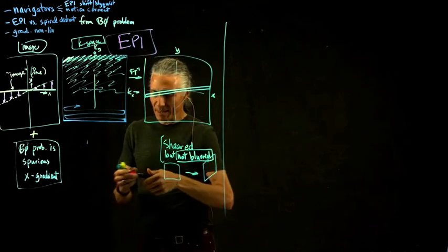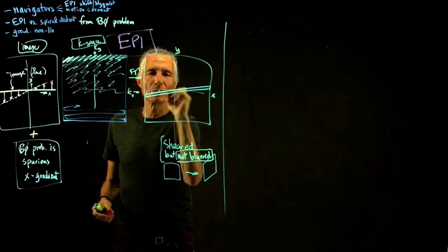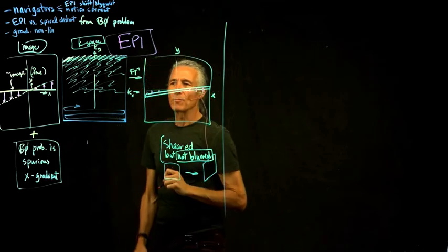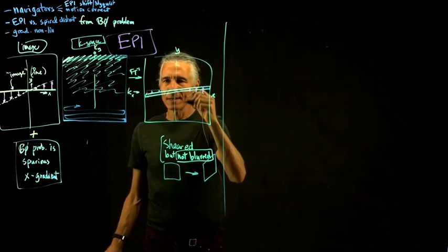That's why essentially this thing only moves in the y direction, doesn't move in the x direction. So all the actual movements in space are just in the phase encode direction.